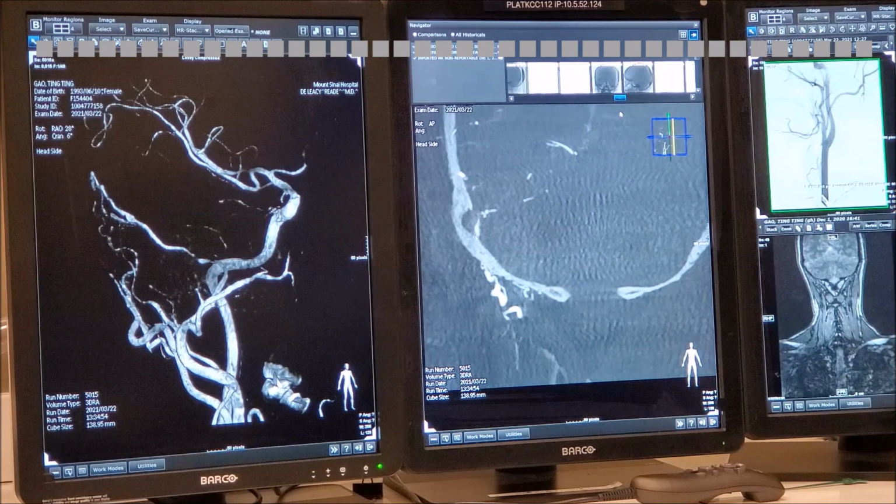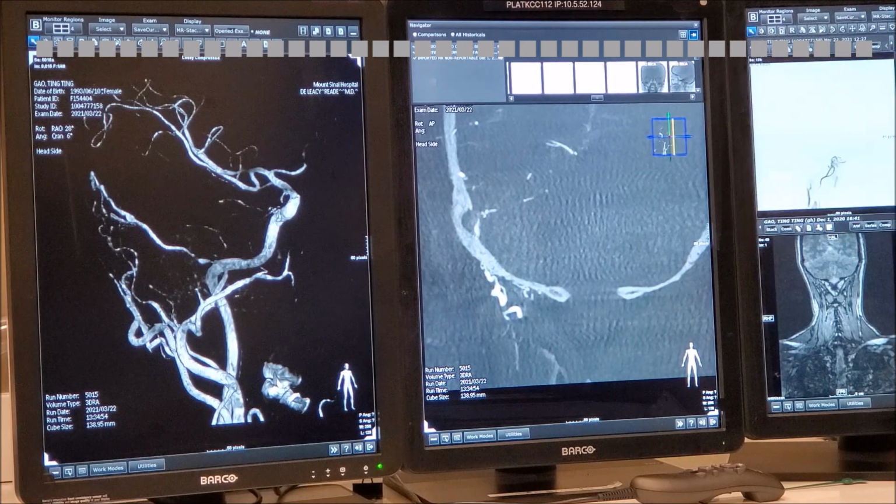I was just wondering if you can see it and show that actually through the bone, since we have both. Yeah, I'm going to try to see it. Where is my occipital? That's the other side. This is the meningeal. Yeah, you're right. Auricular. So Tom was right. That was the left occipital. Yeah, but you're injecting the right side here. So, okay, let's go to the dural fistula.